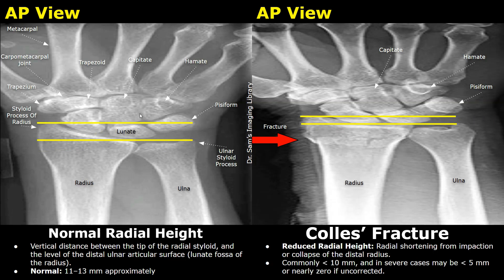The radial height can be measured by drawing a straight line that touches the radial styloid process and a second straight line that touches the lunate fossa of the radius. We can measure this vertical distance — normally between 11 and 13 millimeters. A reduced radial height indicates radial shortening from impaction or collapse of the distal radius. In this image you can see the overriding of the distal fracture fragment — this is an impacted Collis fracture. Usually this distance is less than 10 millimeters in a fracture, but in severe cases it can be below 5 millimeters or even 0.